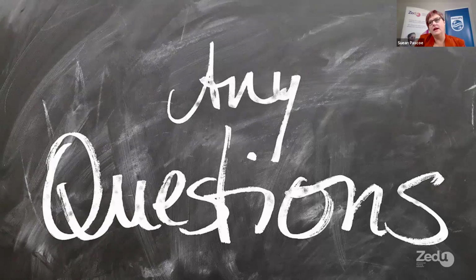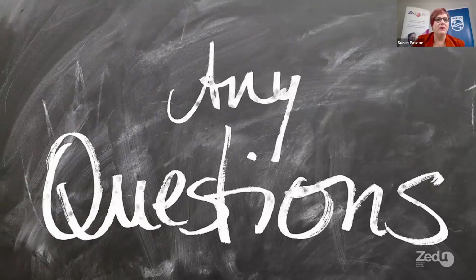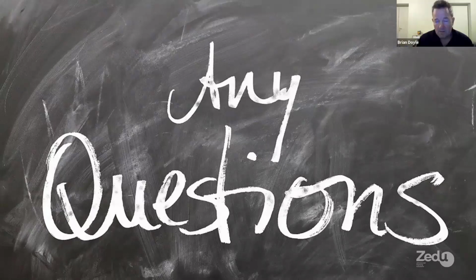So it gets back to that clinical question. Does going after that to the nth degree, is that just a nice to have and someone's done some great research paper on it, or does it actually add to how you're going to clinically manage it? And I don't know that it gives you that much more than if you're just looking at the colour, and you can get colour well.